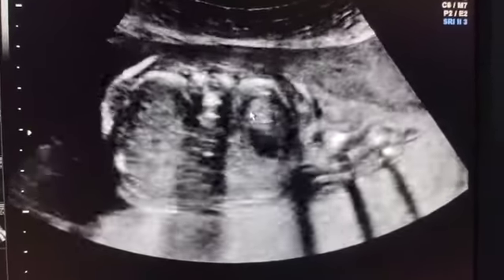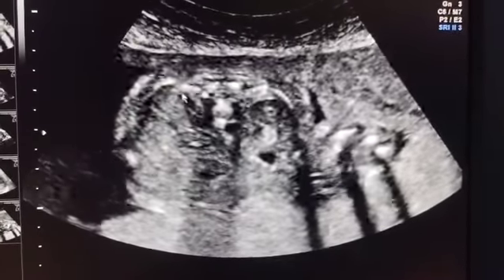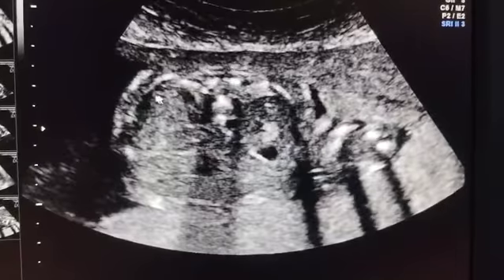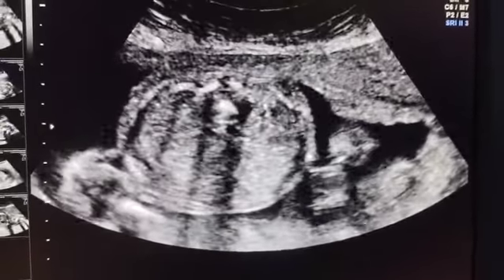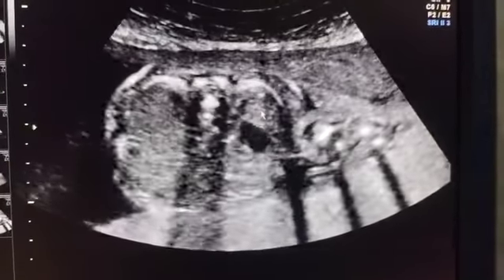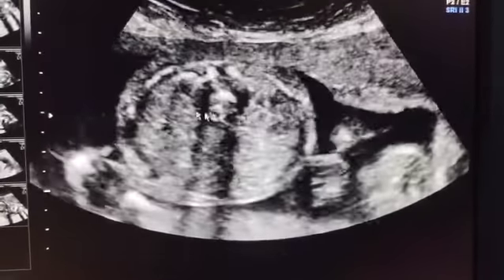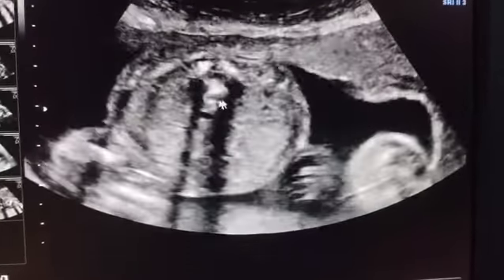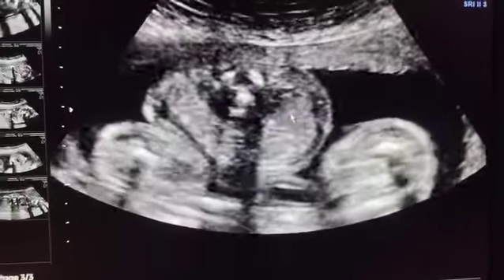So this is the left side, and as I go down, this is the adrenal gland that is seen here on the right side, but renal echoes are not seen. Whereas on the left side we see the adrenal, and below the stomach, this is the renal echoes. So we don't see renal echoes on the right side, and as we go lower down, the renal echoes are still seen till here.